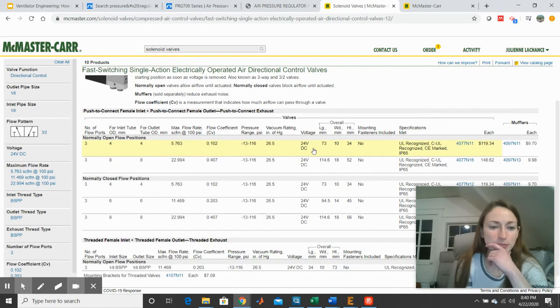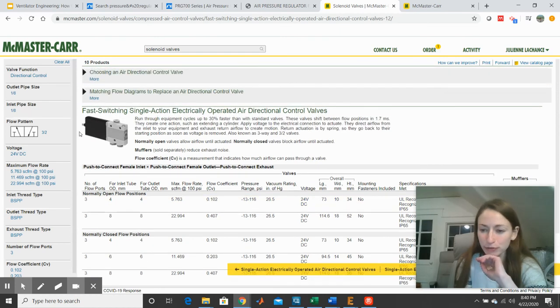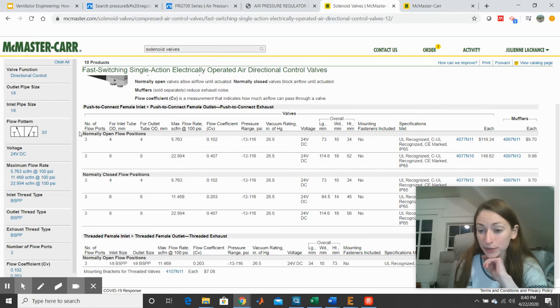Okay, so now looking at this website, let's see what we have. We have categories based on whether the valves are normally open versus normally closed. So depending on your application, this could really impact the safety of your device in the event of mechanical failure. So if I have a valve that's very close to the mouth of my patient, I may want it to fail open in the event of some mechanical failure so that the patient can attempt to breathe normally if they're still physically able to breathe. So be very mindful of this when you're designing the safety components of your device. You may want it to fail open. So I'm going to design for that. I'm going to have mine normally fail open.